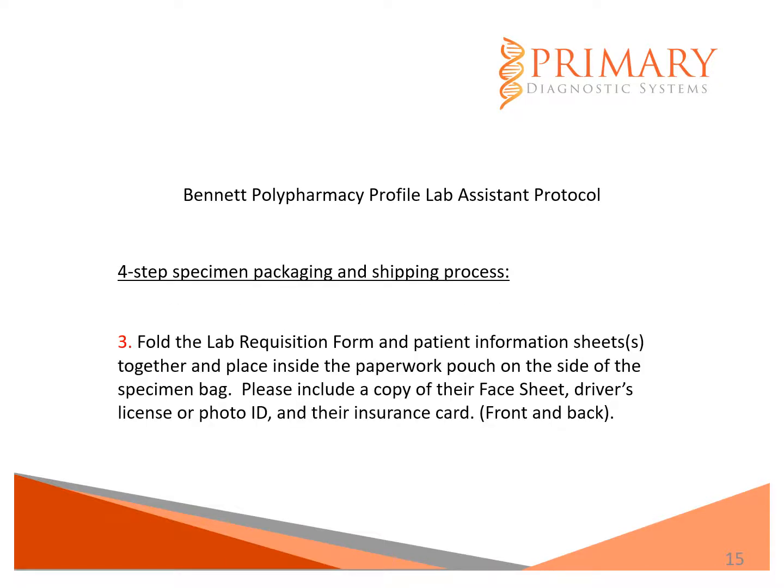The third step in this process is to fold the lab requisition form and patient information sheets together and place these inside the paperwork pouch on the side of the specimen bag. Please include a copy of their face sheet, driver's license or photo ID, and their insurance card. Please copy both front and back.